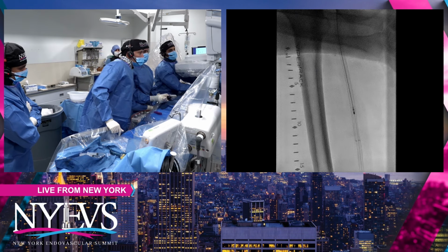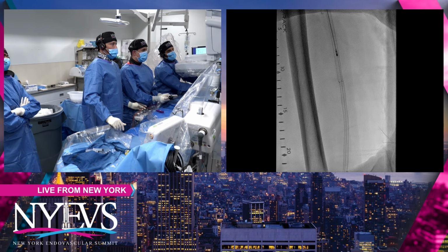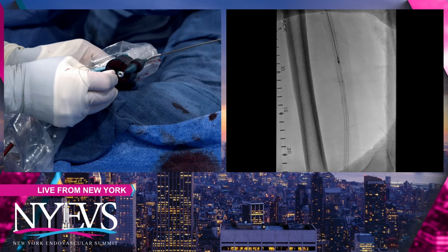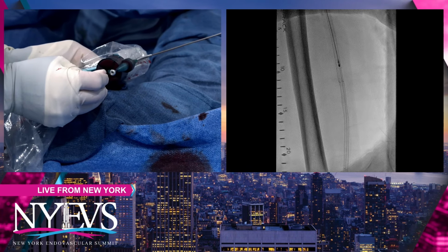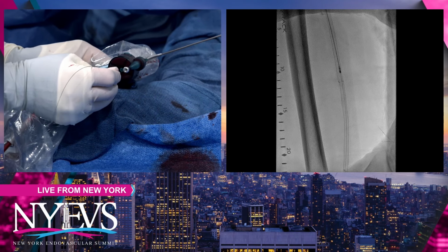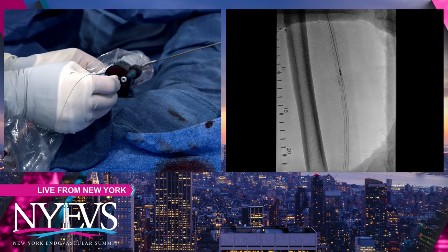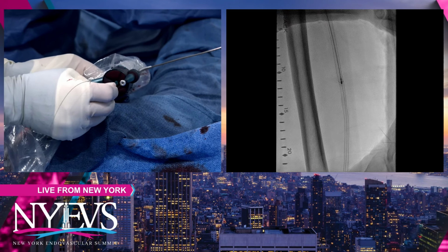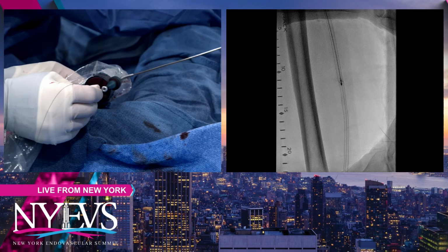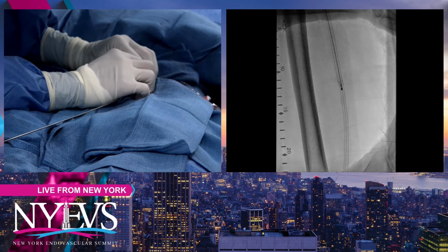Just for the audience, one of the learning points which they teach you with Rotarex, and I'm sure everybody in the panel would agree, is that pecking motion of going back and forth. Usually with other devices, other orbital or rotational, we have a habit of just going in and out. But in this case, going back and forth, the pecking motion, is what's recommended. It's probably to add both the aspiration and the atherectomy part so that it functions well. But also on the back end, make sure you keep on squeezing that little tubing, because at about 7 or 8, we were getting some more change in the drive speed.